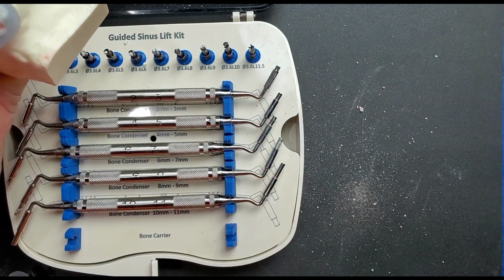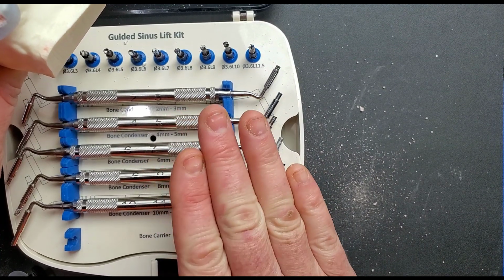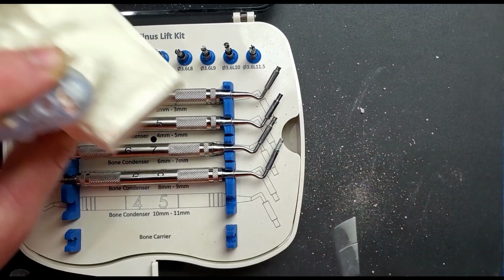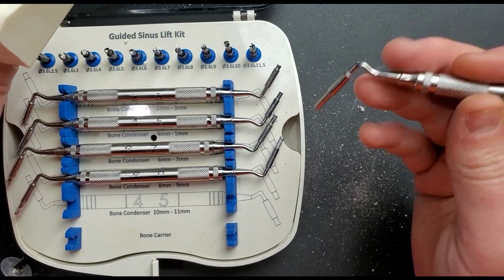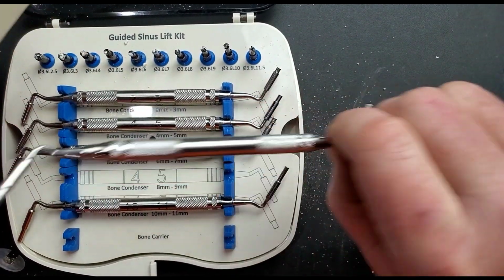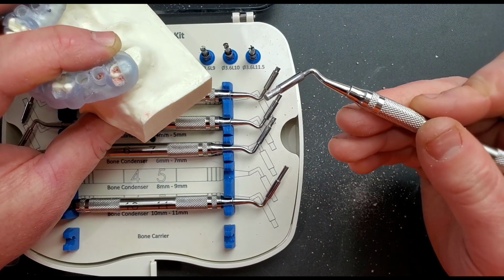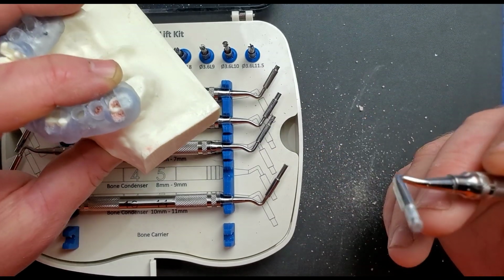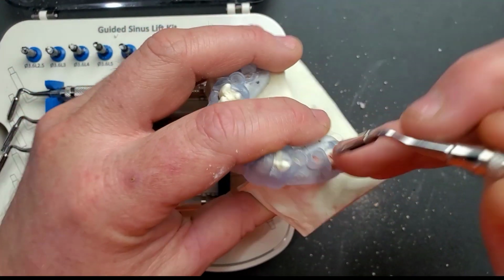Now, if you remember, we broke through at 8mm, and this is the next step where you potentially could go wrong. If you now just went and started poking in there really deep with a plugger that doesn't have depth control, you could very easily cause a perforation. With these, again, you've got a built-in stopper on your graft carrier. Okay, so there's no way that I can push this deeper than that 8mm where I know we broke through. That's going to make sure that the graft material is the only thing putting pressure on the membrane.